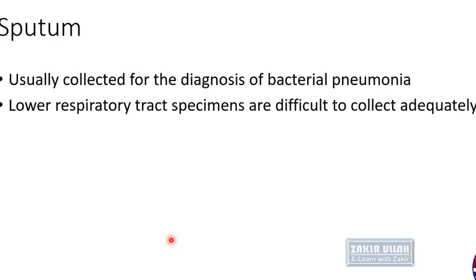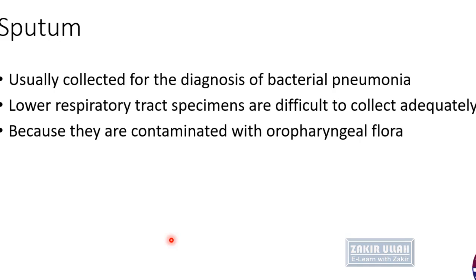The lower respiratory tract specimens are very difficult to collect adequately because the patient has to try harder for the collection of this type of specimen.